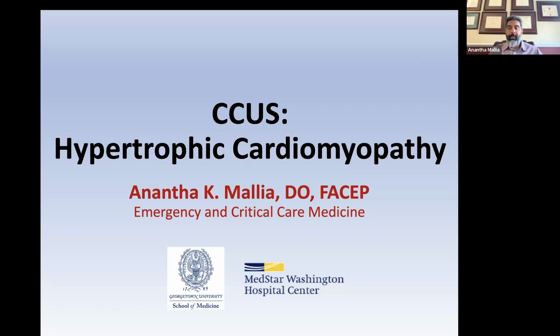But number one, being able to identify the disease state will clearly have direct implications on your hour-to-hour, day-to-day management of your critically ill patient, especially if they're in shock. And number two, just like with other similar didactics like aortic stenosis, this echocardiographic identification of HCM takes the skills and knowledge that you already have, and allows you to apply them in a different way, a different context. So with that, let's talk about HCM.